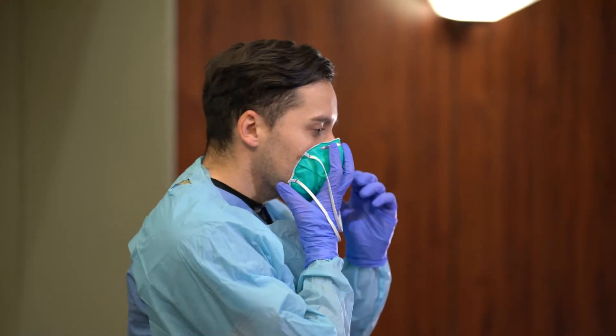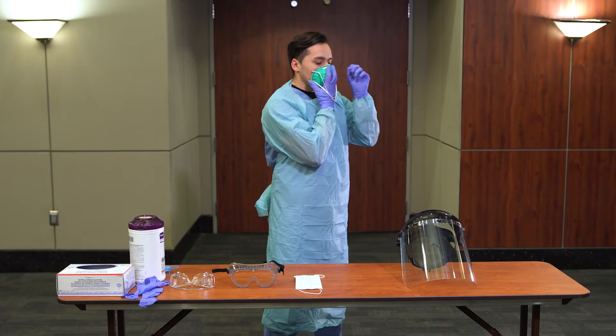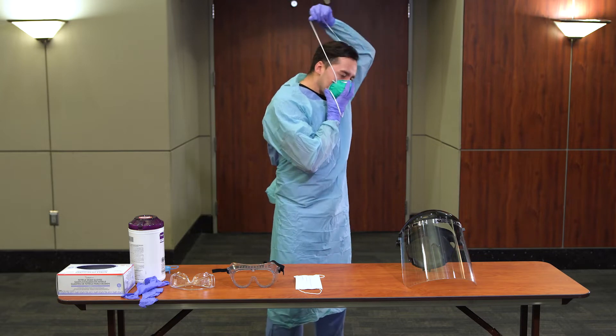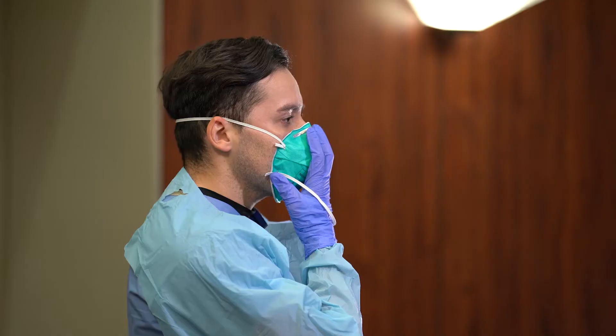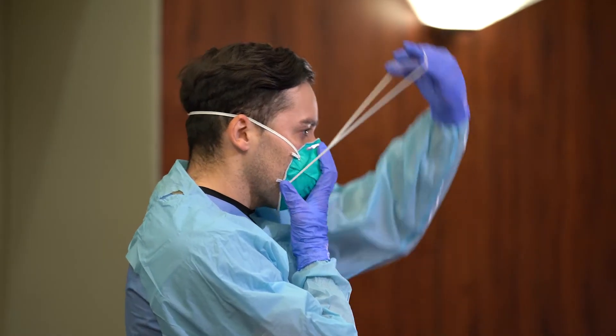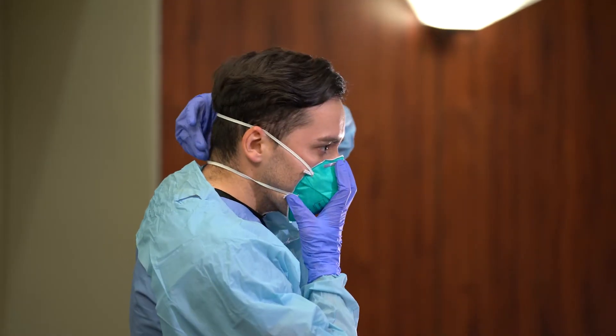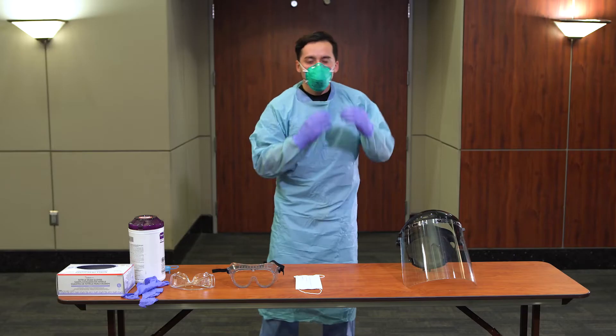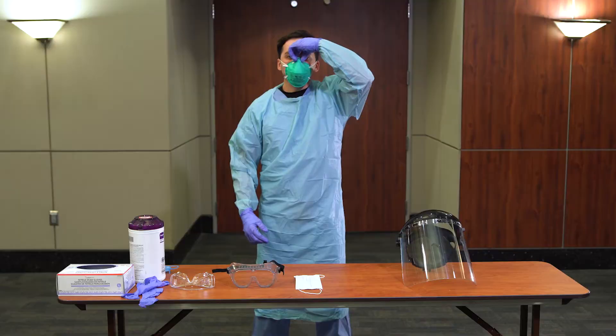Don an N95 mask for which you have been fitted. Start by placing the mask around your mouth and nose with one hand while moving the top strap around the back of your head with your other hand. Keep holding the mask and move the bottom strap above your head and around the neck. Using your thumb and index finger, pinch the metal bar around the top of your nose.